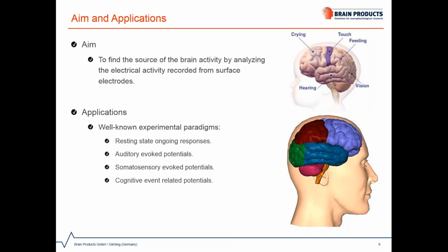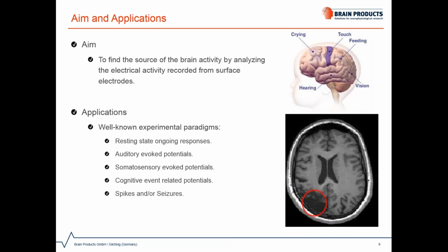Source analysis techniques have also been developed to provide insights on cognitive processing, which is the core function of the frontal cortex. It has also been shown to be a very useful tool in clinical environments as pre-surgical planning for patients diagnosed with different forms of epileptic spikes or seizures, in a non-invasive way, by localizing the epileptogenic zone responsible for creating the abnormal EEG signals.